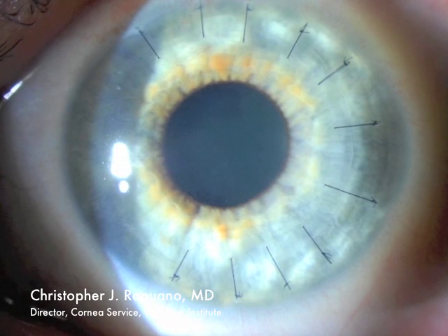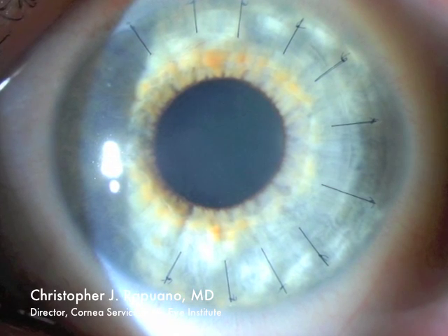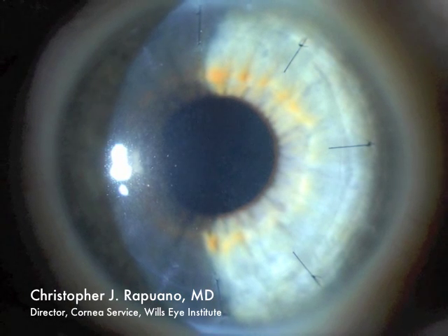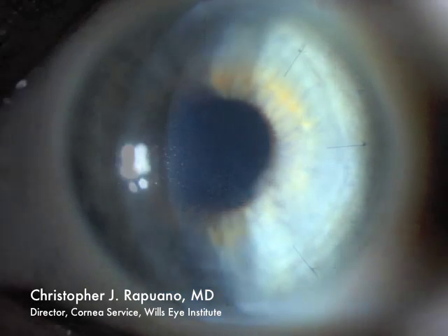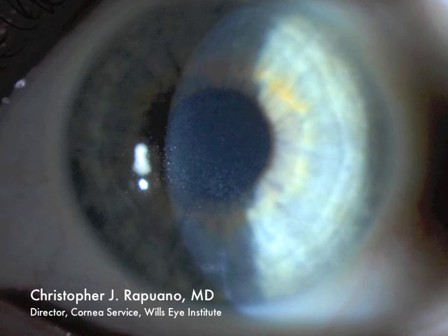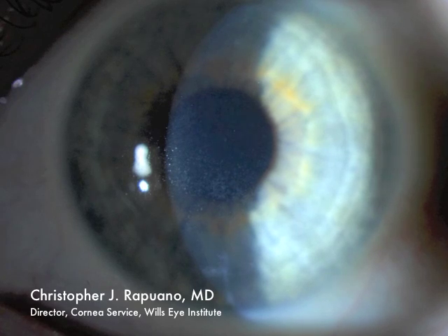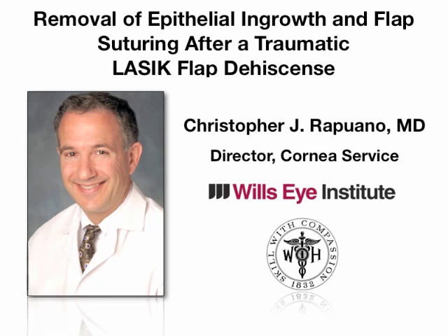I put one suture in, and here's a second suture — I will eventually put in about 14 sutures. Here's a photograph of the patient's eye about one week after surgery; the sutures are in good position. I've taken half of the sutures out about six weeks after surgery and there's no evidence of epithelial ingrowth. Here's the patient about three months after surgery, after which I've taken all the sutures out and there's no epithelial ingrowth.